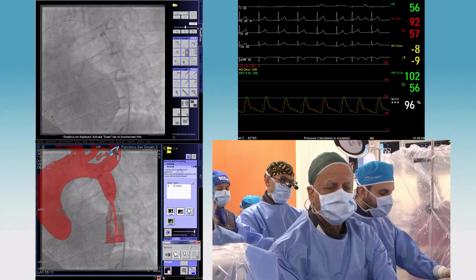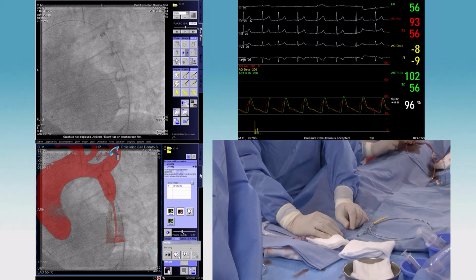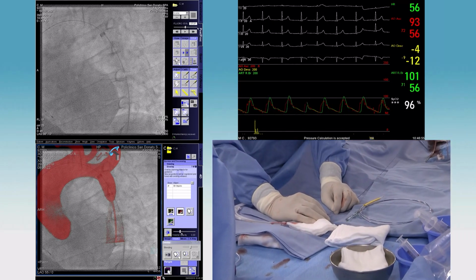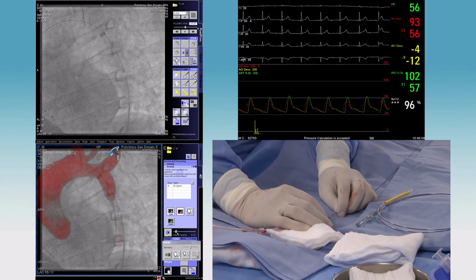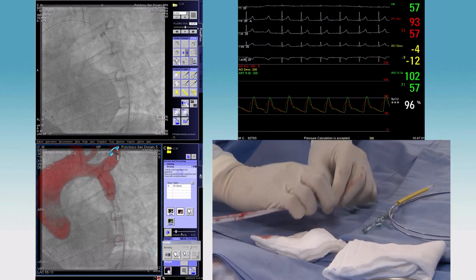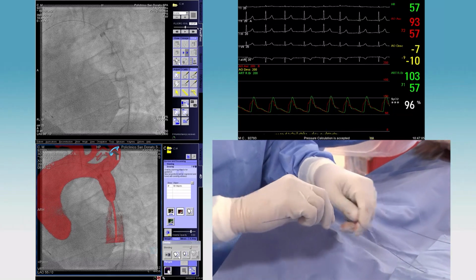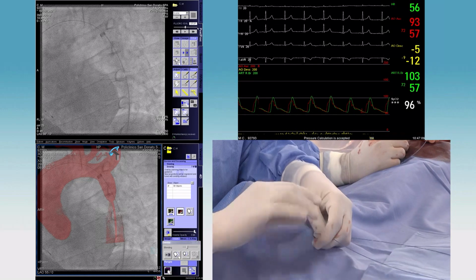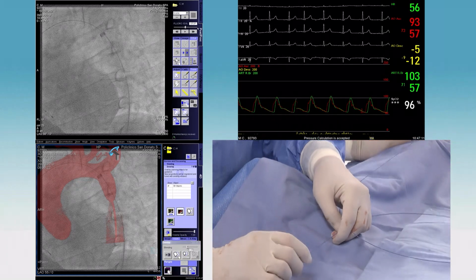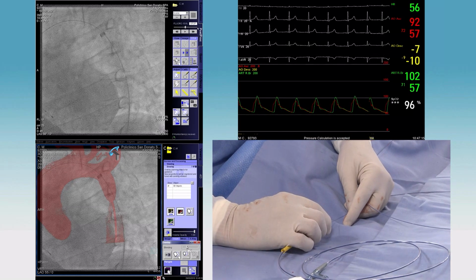Does the stent shorten? Yes, so if we inflate this 18 millimeter to full 18, the 48 length shortens to around 41 millimeters. So there is some shortening there. The other thing is that although we use an indeflator, the balloon does have some extra volume leeway, so you can overdilate.